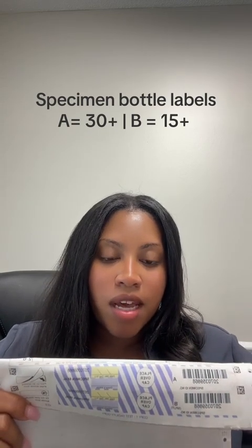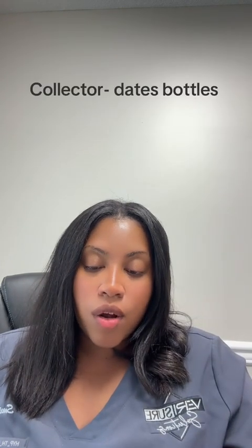B is going to go on the one that has 15. And again, that's going to be when you pour the urine inside here, you're going to close it, and then you're going to place this label on this bottle, and then this centerpiece goes here on top, and then you want to go ahead and place the label alongside this so that it is secure, and this is what the label looks like.